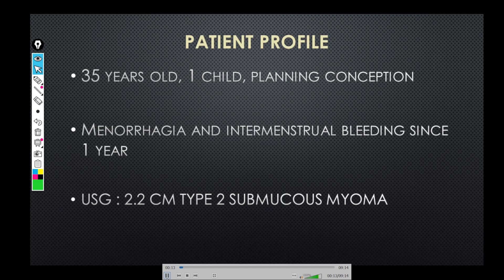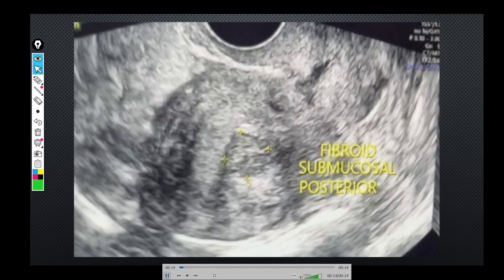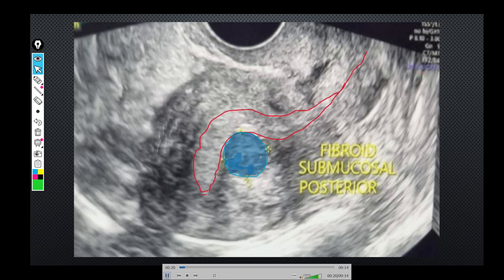Before starting, it is very important to know the FIGO grading of myomas because you will have to interpret the ultrasound before starting the surgery. This is the image given on the ultrasound film and though the image is not very clear, we can get a fair bit of information from it that helps us to actually plan the surgery. This is the fibroid which has been seen, and if you look at the image carefully, this is how the location of the fibroid is.